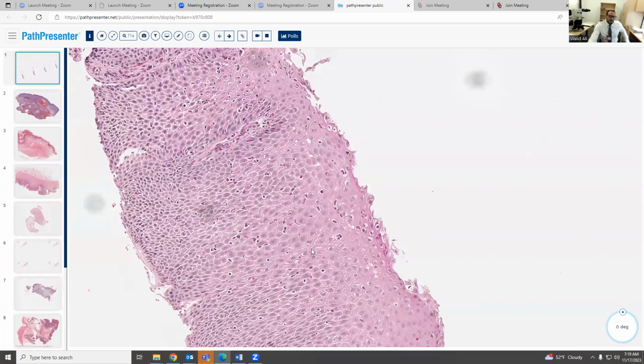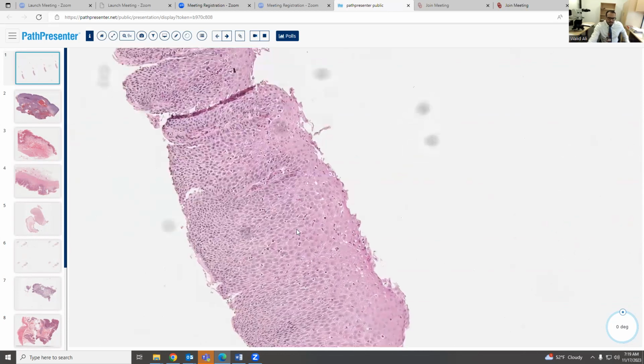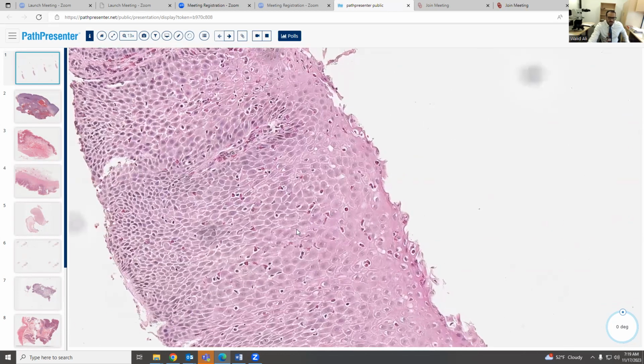Sometimes, even in eosinophilic esophagitis, you might not see all this. So when the GI clinician is suspicious of eosinophilic esophagitis, they take biopsies from the upper esophagus and lower esophagus. The reason is the differential diagnosis, which is GERD; in GERD you can also see some eosinophils in the squamous epithelium.